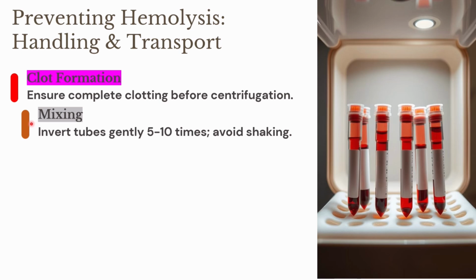Second important thing which we should keep in mind is proper mixing of the samples. We should invert the tube gently 5 to 10 times for mixing the samples. We should avoid the shaking of the samples.